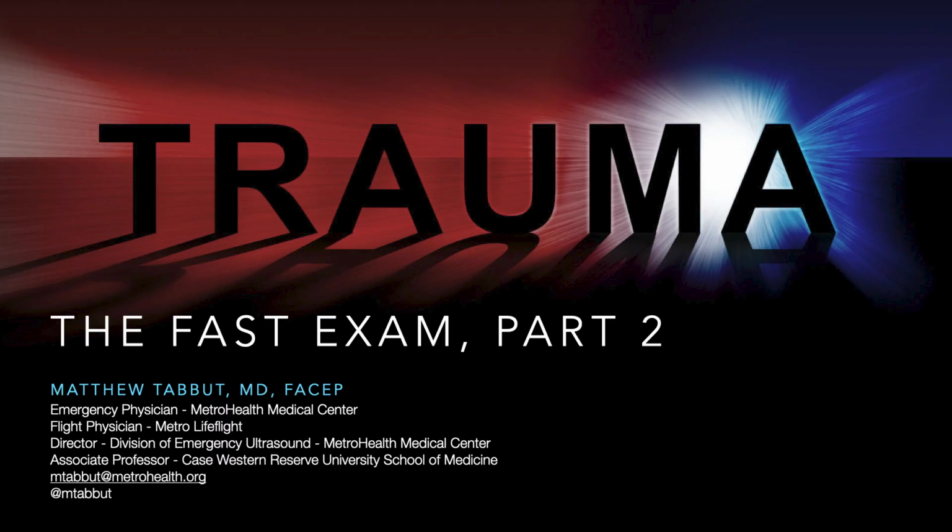So last week we started out talking about trauma, some of the basics of trauma ultrasound. We're going to finish up the trauma exam today, doing part 2. And so without further delay, let's head on over to the trauma exam part 2.